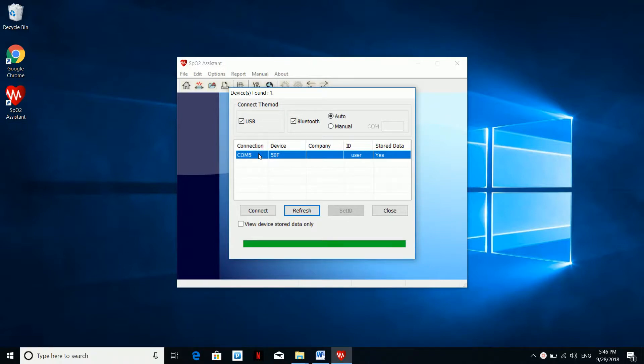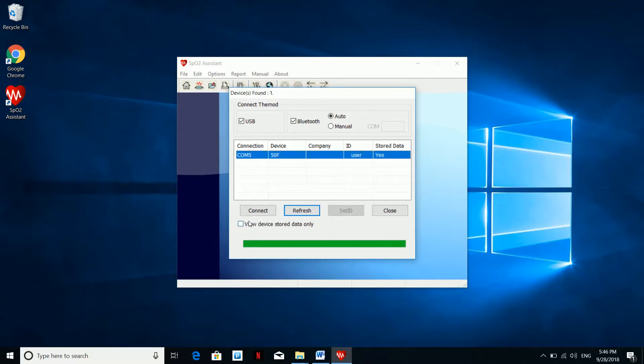This step is the most important one. Select the device by highlighting it and at the bottom select view device stored data only before hitting connect.